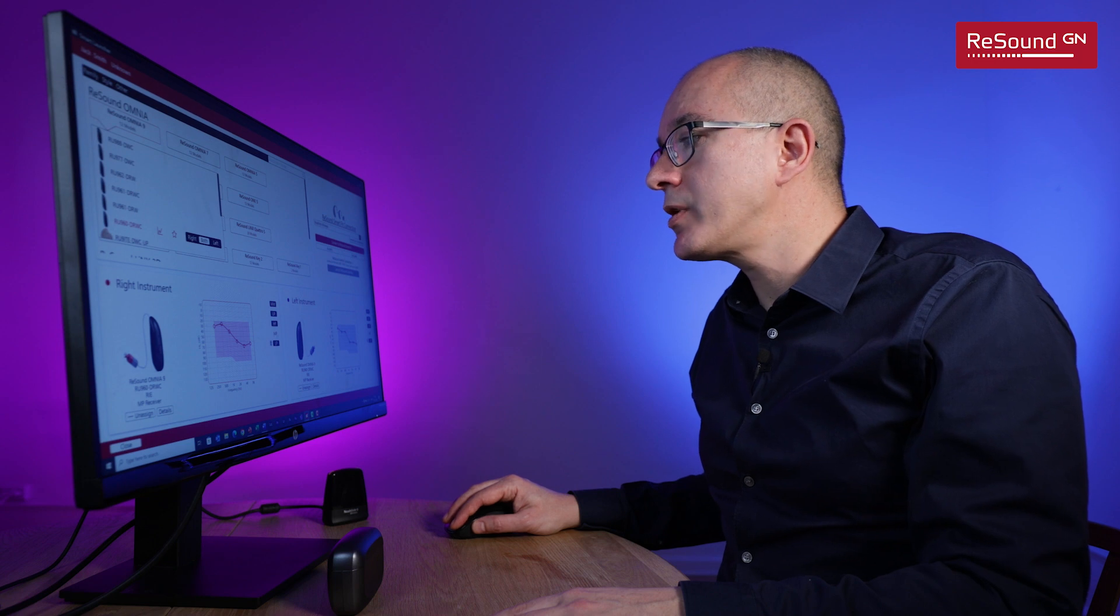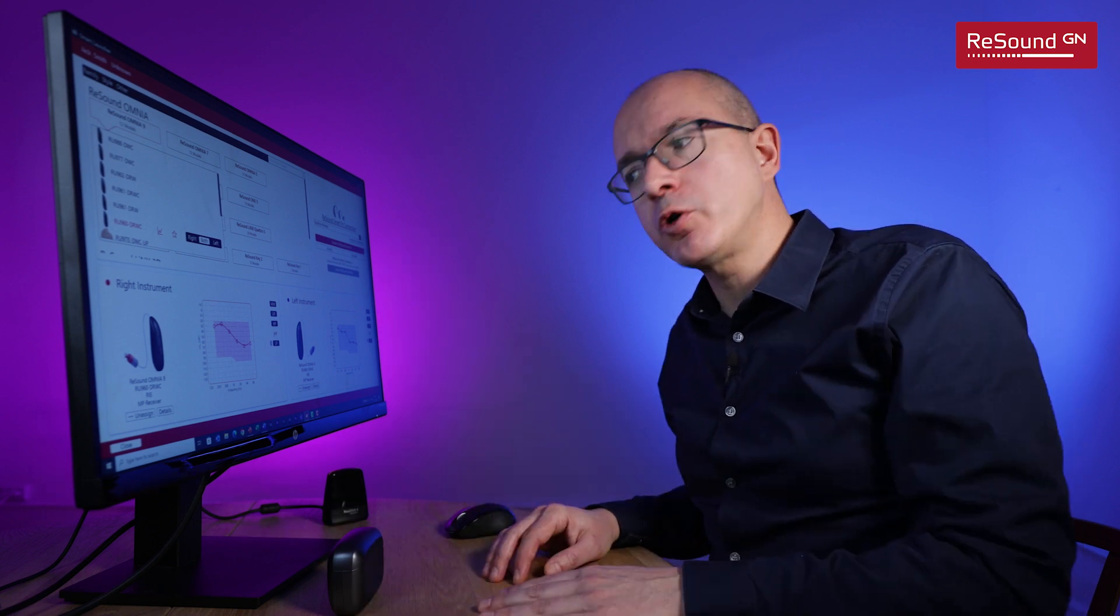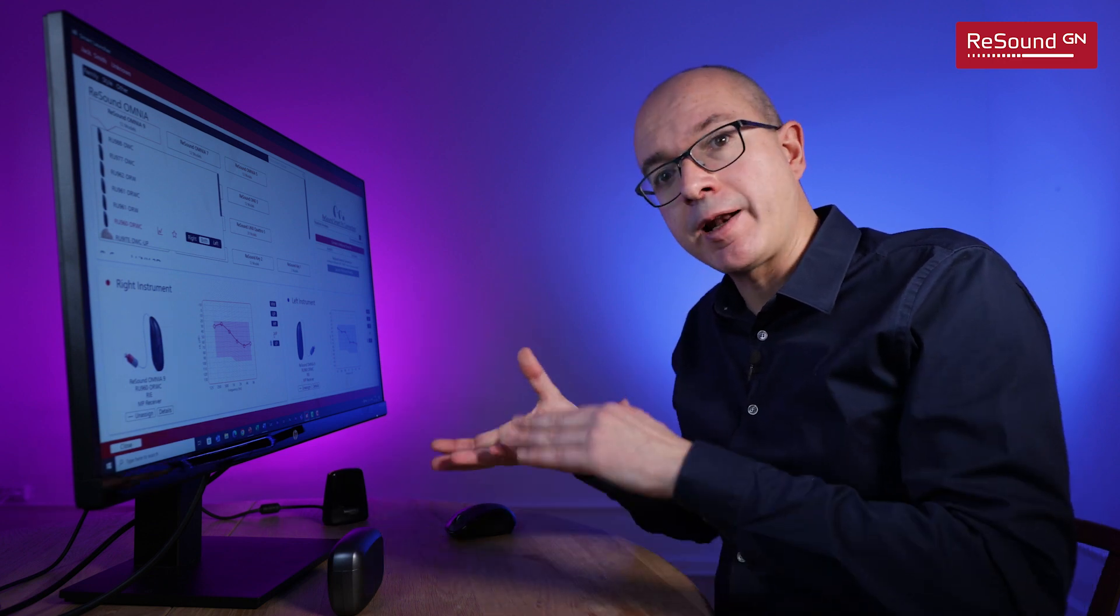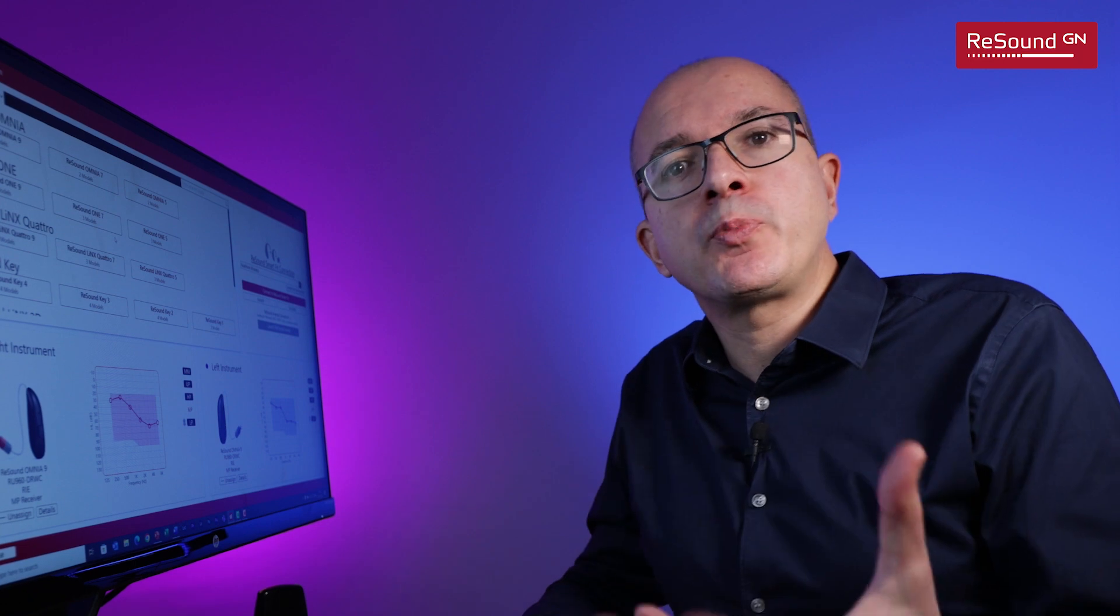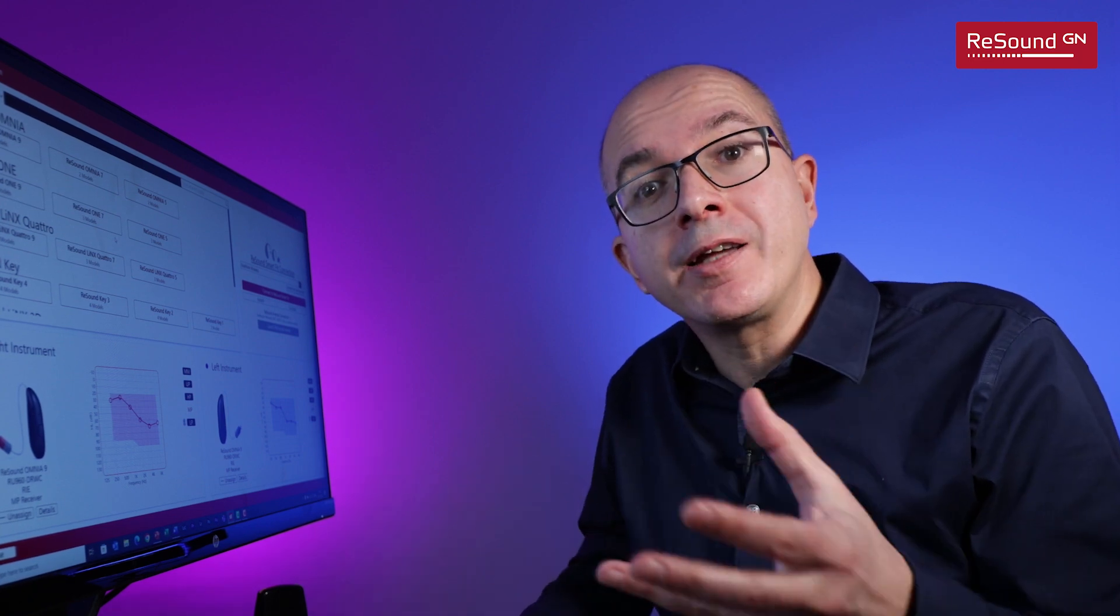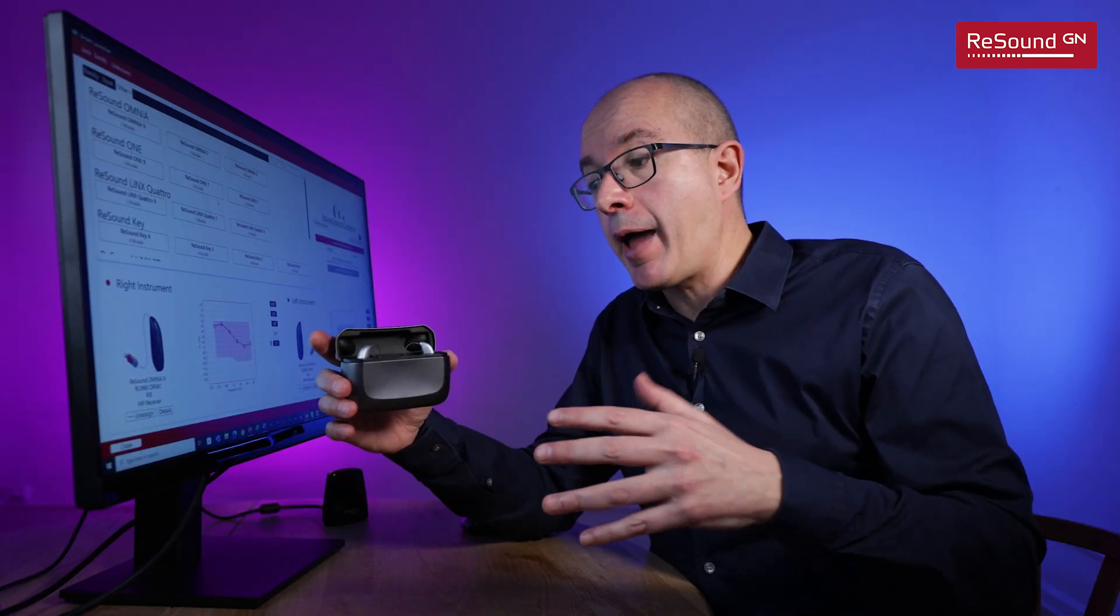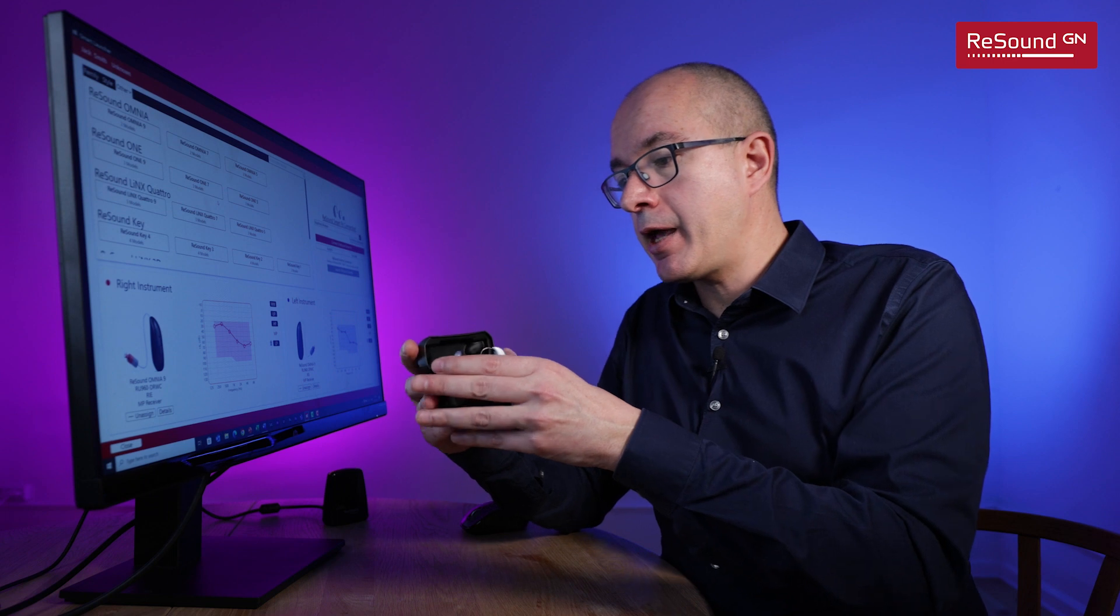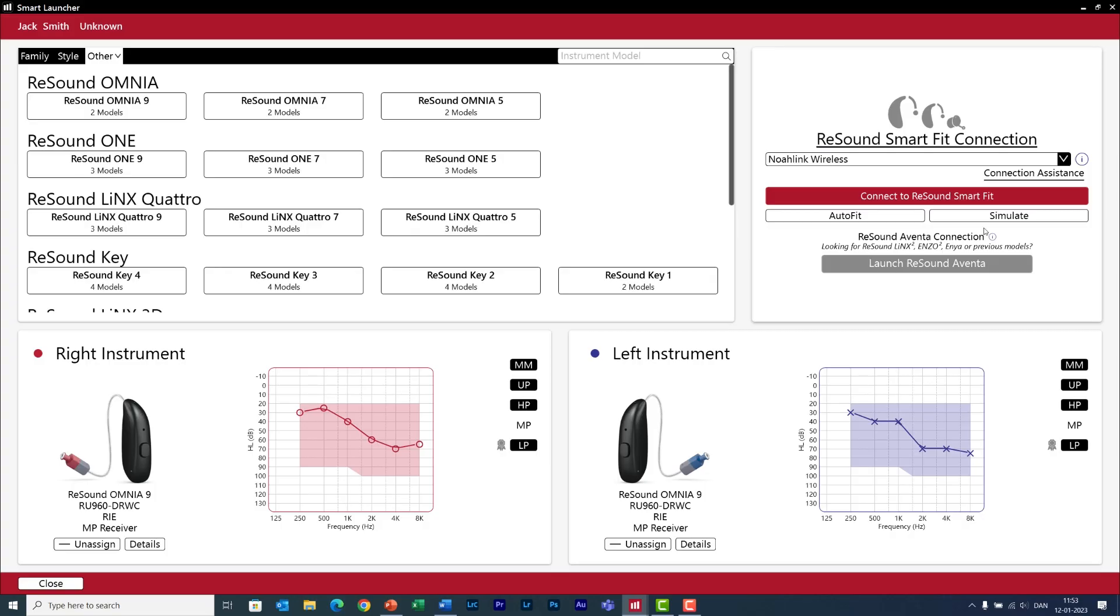So in our case for Jack the fitting software recommends a low power receiver. Now I've chosen a medium power receiver because I want to show you what happens with the feedback calibration and I want to have a receiver that allows me to give more power. To be honest I don't normally use this section and that's because when you get a bit of experience with ReSound you immediately know which hearing aid fits best the needs of your clients.